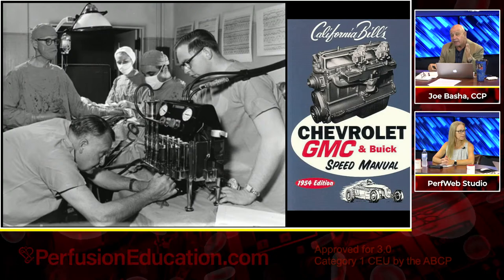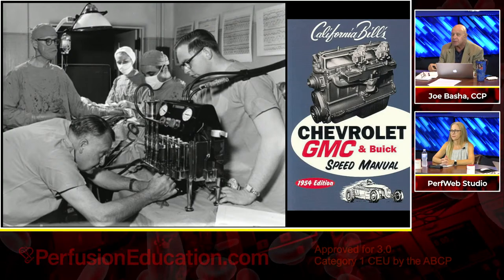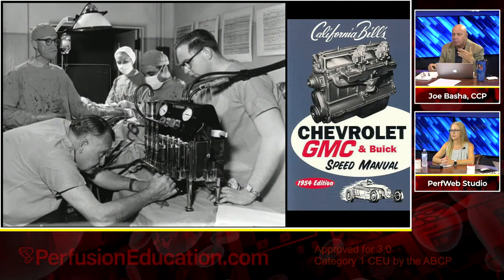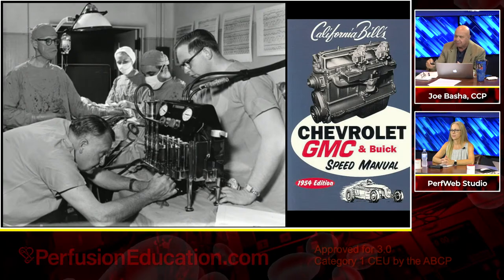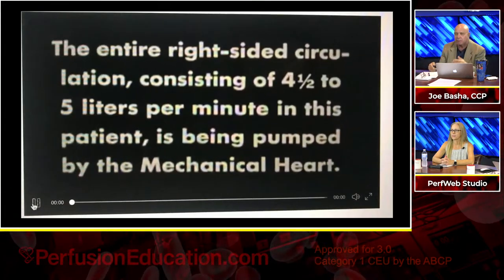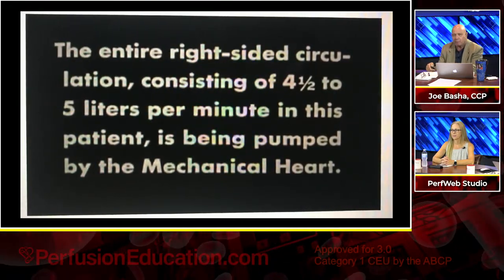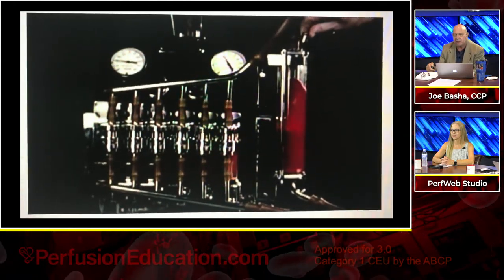So with that said, if you look at the machine and you look at a General Motors straight six engine, you see the influence General Motors had on the way this thing was built. And here it is actually running on a patient. You'll get to see that. And there it goes. You can see the blood in it.